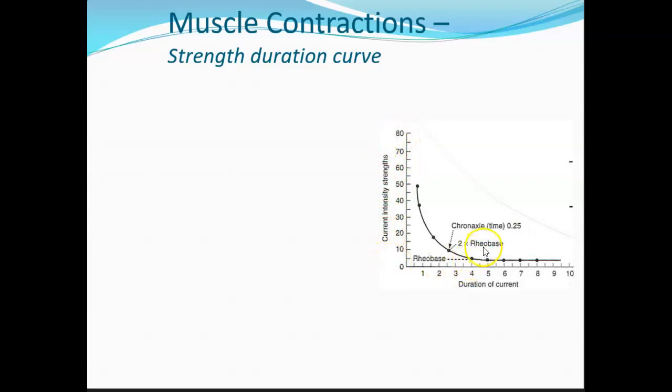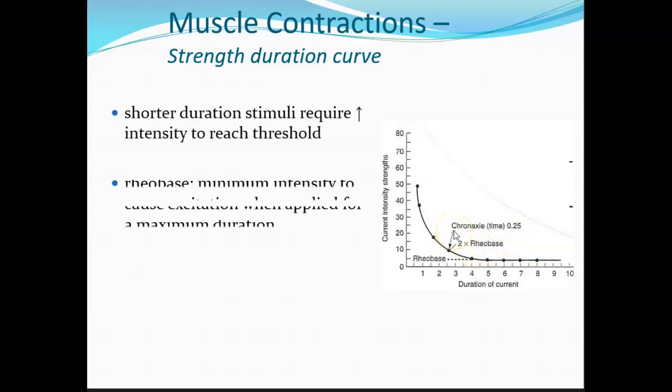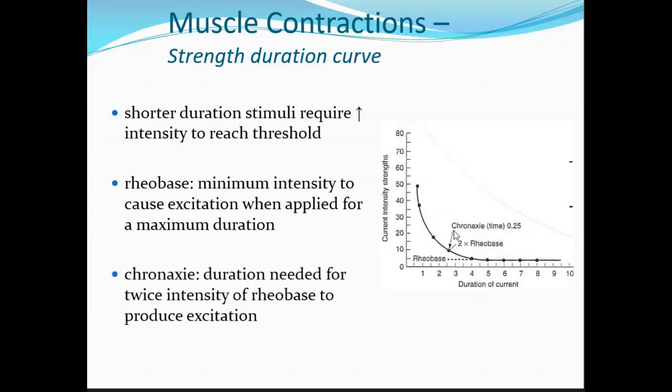There's two things that I want you to realize on this graph, this concept of rheobase and chronaxie. I'm going to put up the definitions. You have the definitions. And so when I look at the rheobase, if we're going to apply this, so if this is at 5, what is this, milliamps, or just 5 milliamps, all right?